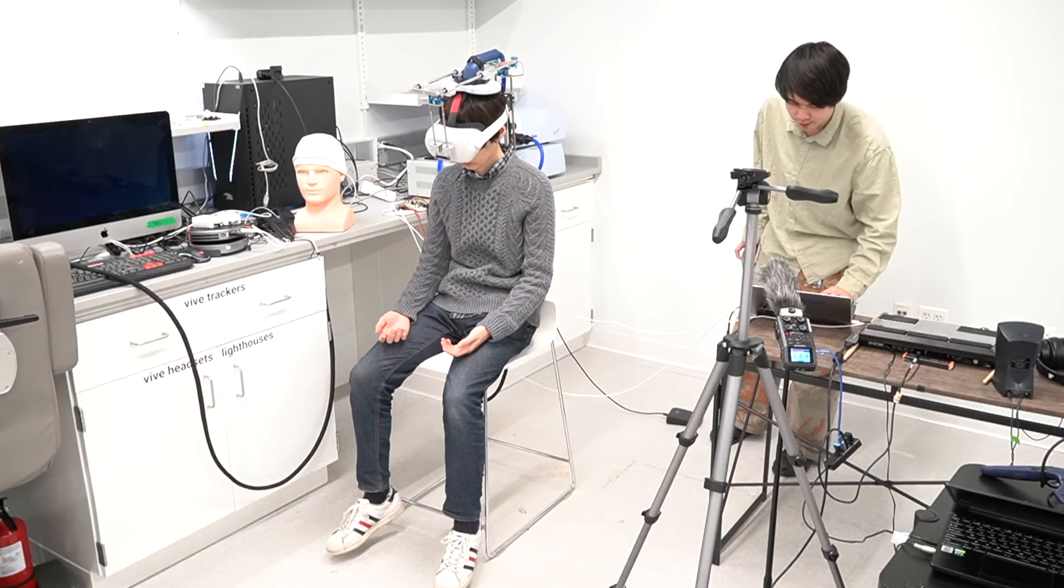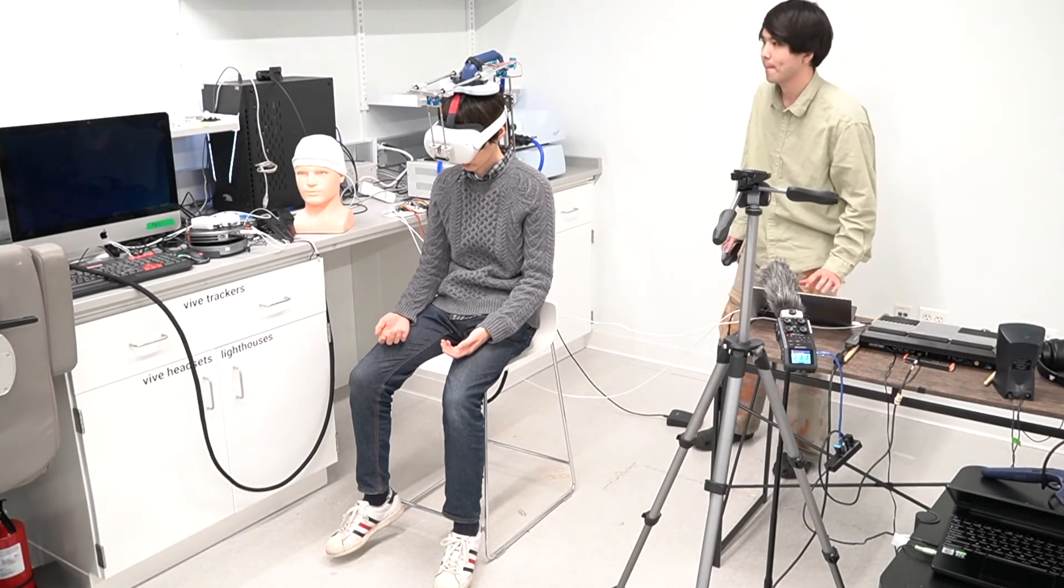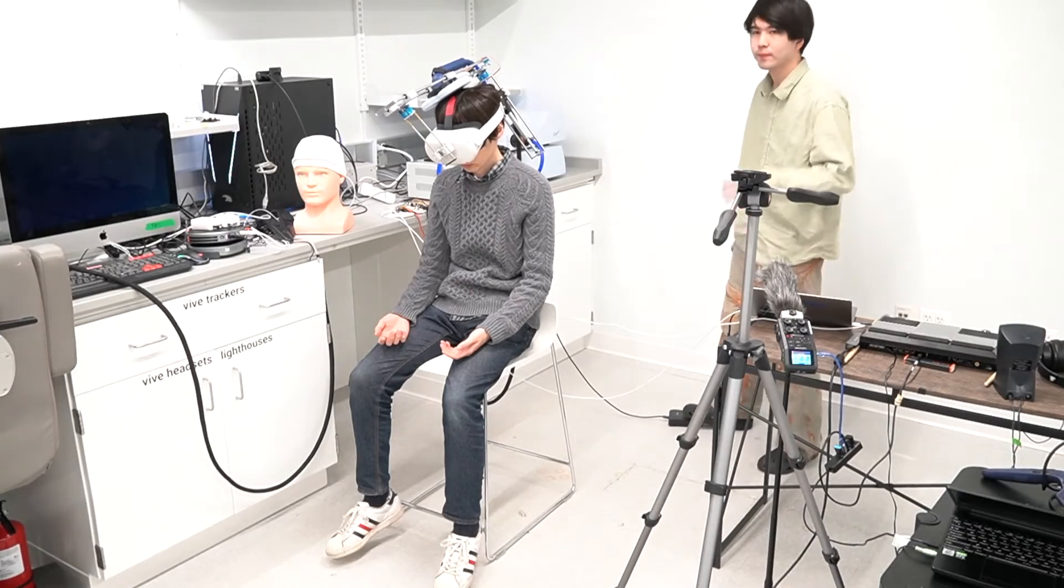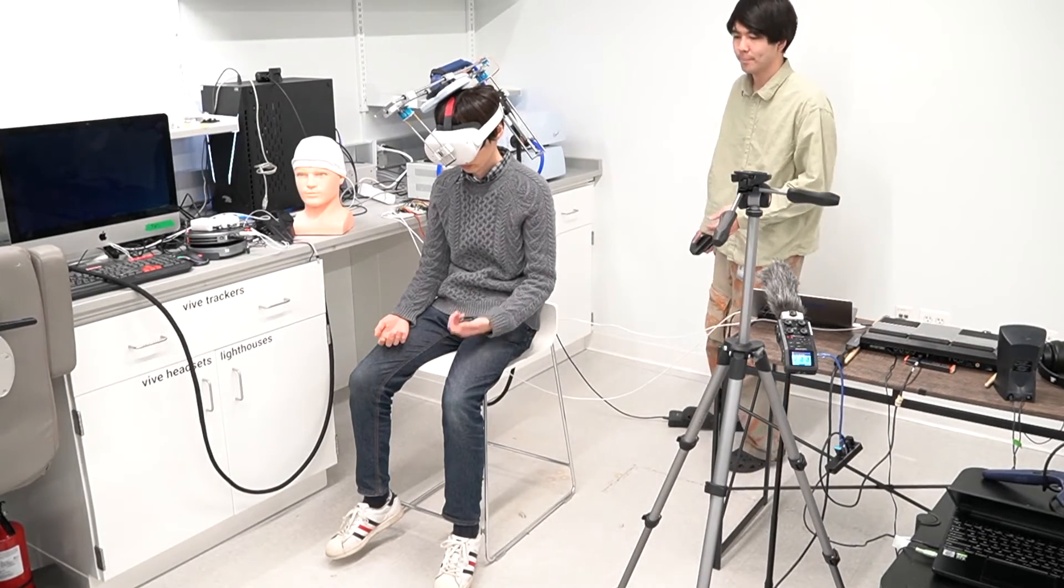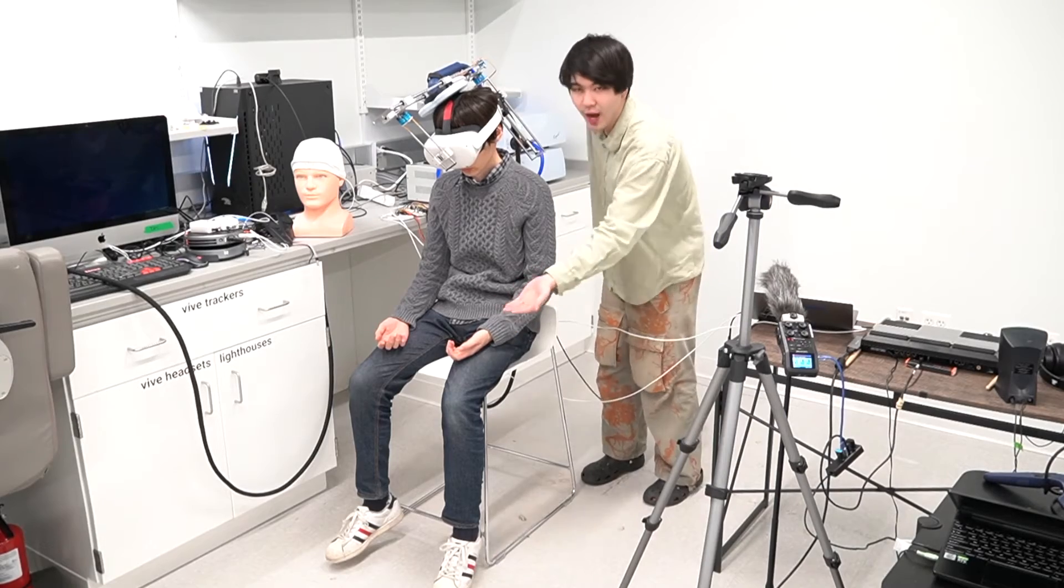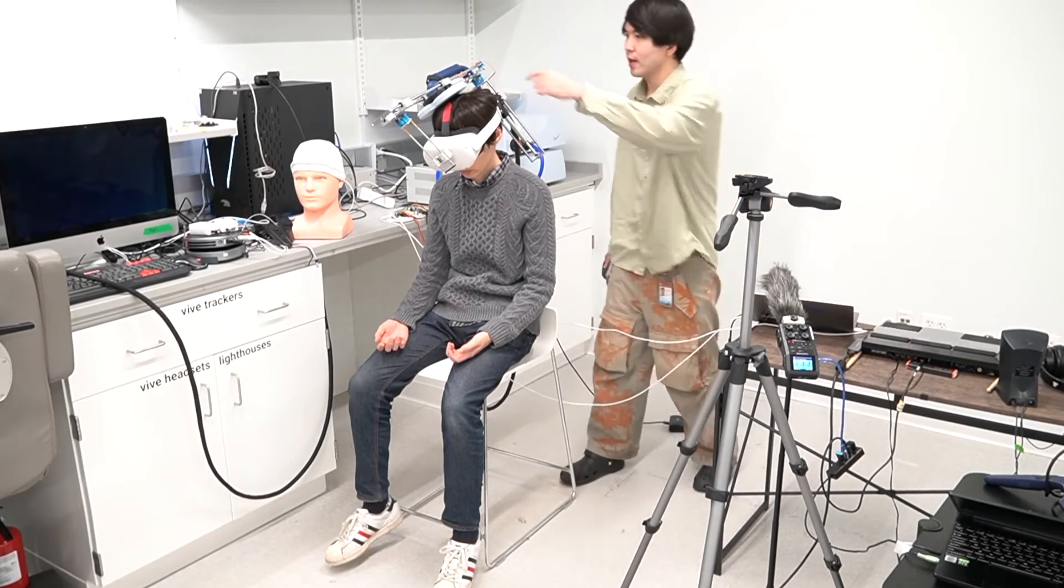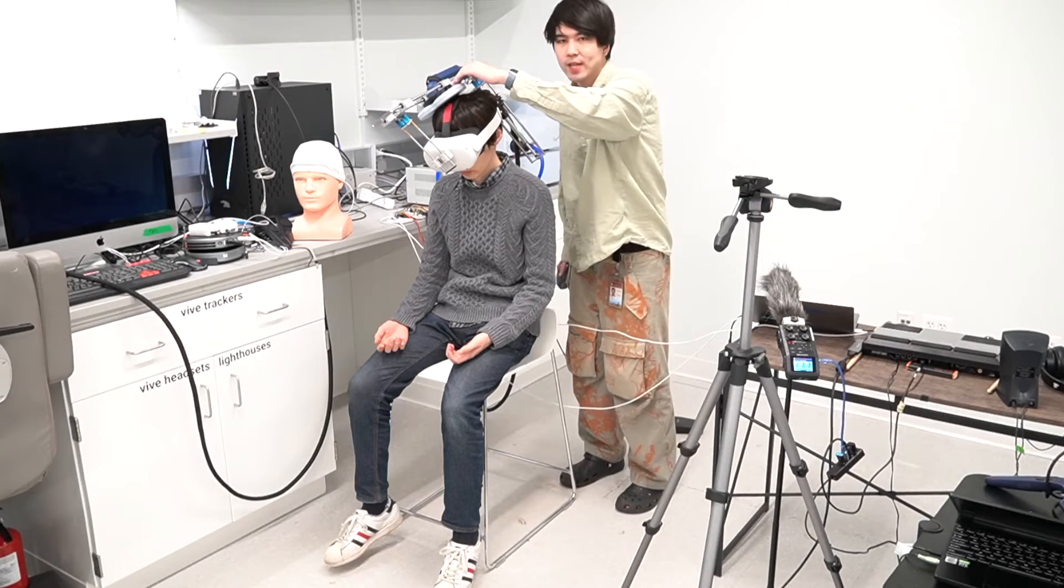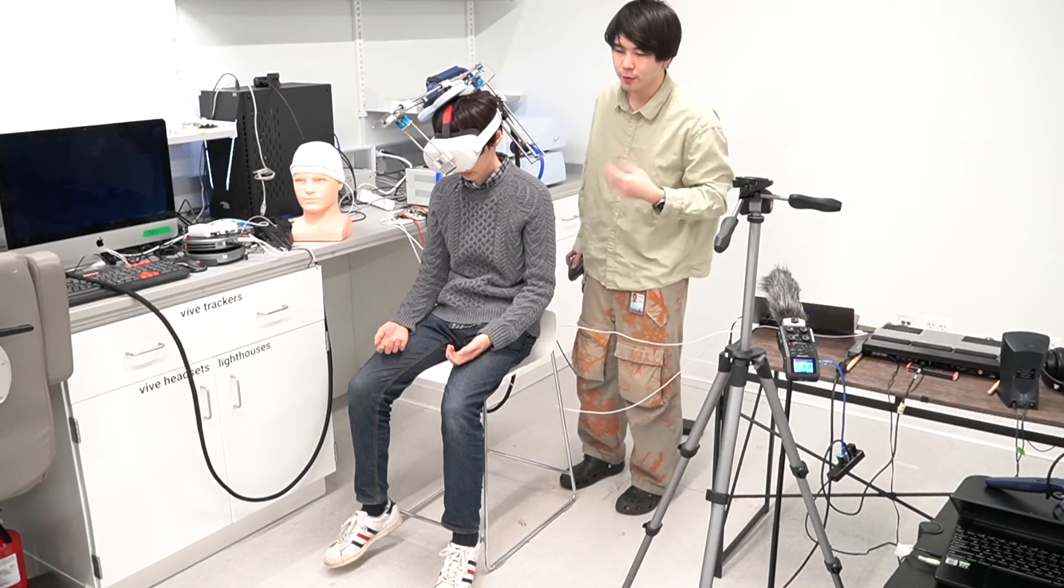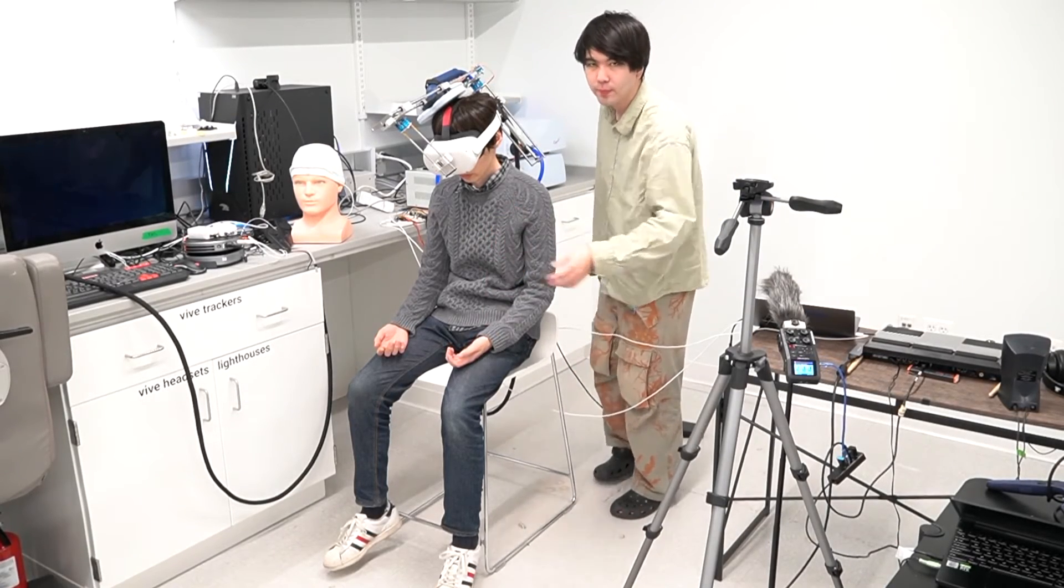So let's first start with moving the coil to this area. And I stimulate. As you can see, Aki's left forearm all the way to the hand moves. And this is because this area of the brain right beneath this coil is responsible for the sensation and movement from his left arm. And that's the principle.